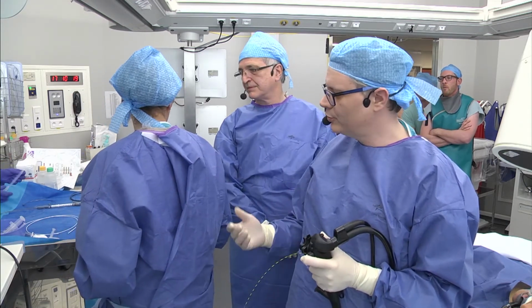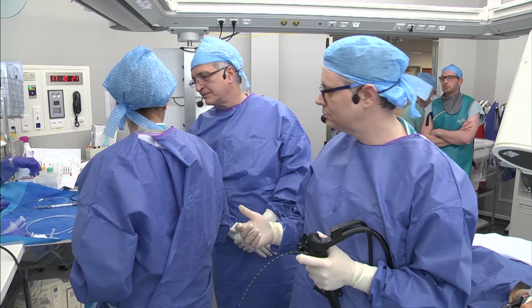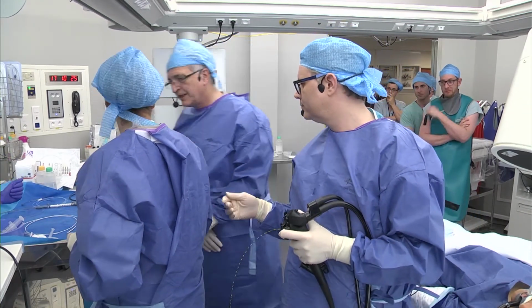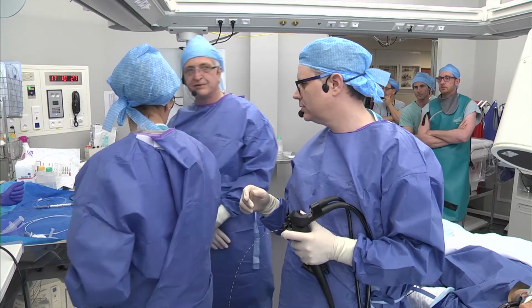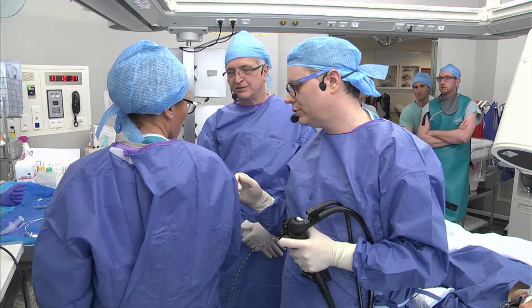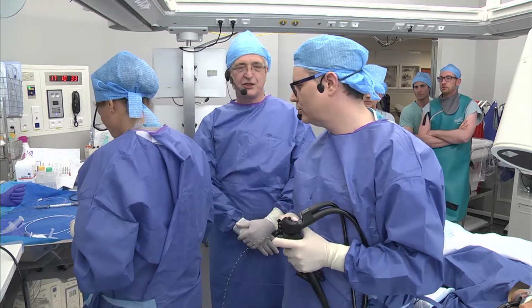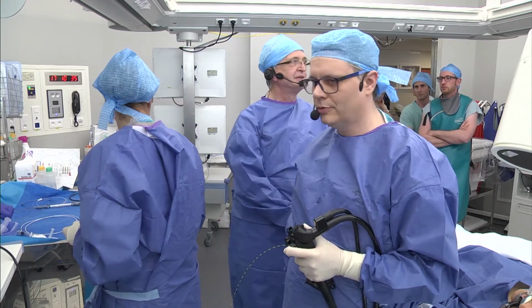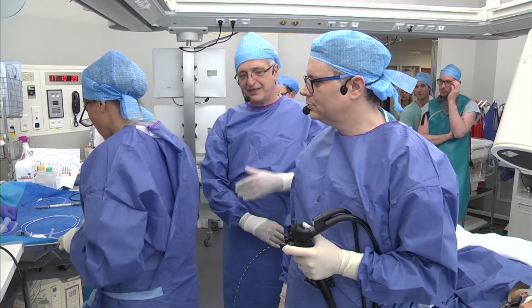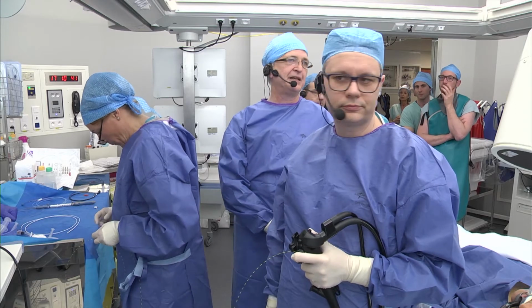Yeah. There is some question in the audience: il n'y a pas de marqueur? You have no marker? Why? Aussi, je préfère un marqueur quand même, si on peut. No, we are just waiting for a black marker to see the basis of the proximal pigtail.